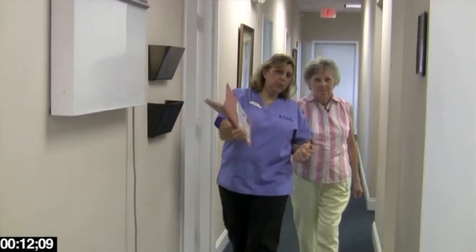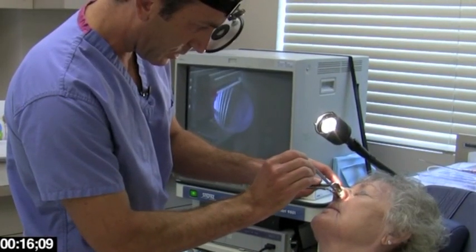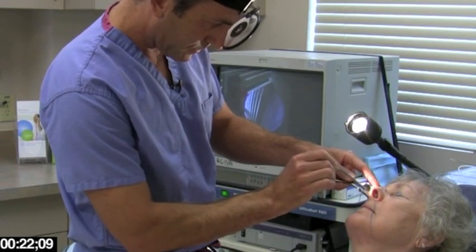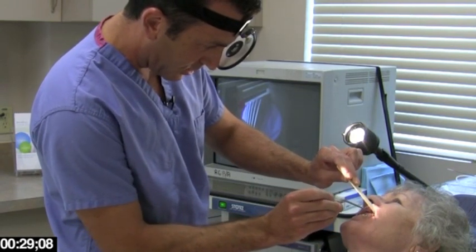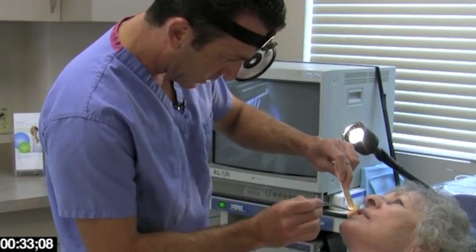The Finesse procedure is a minimally invasive office-based procedure performed under local anesthesia. The patient I performed the Finesse procedure on today came in with complaints of recurrent sinus infections and allergy symptoms. I treated her aggressively with medications and allergy shots, and she received numerous courses of antibiotics. Despite this, she continued to have symptoms and needed recurrent courses of antibiotics.